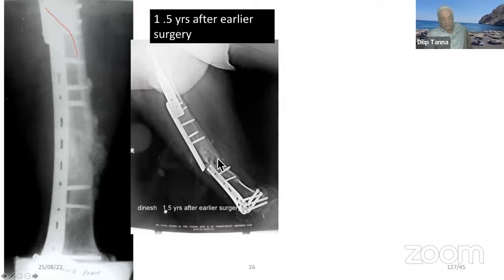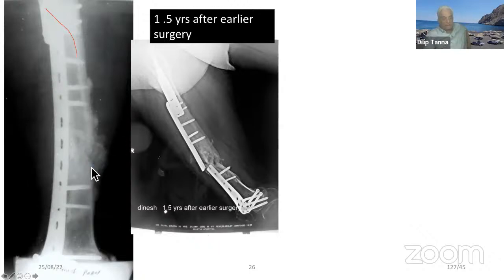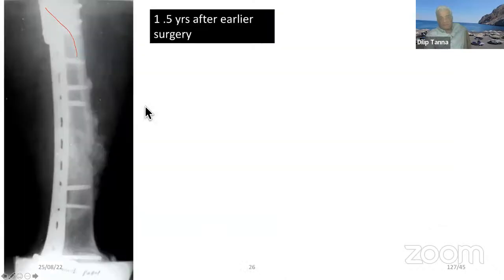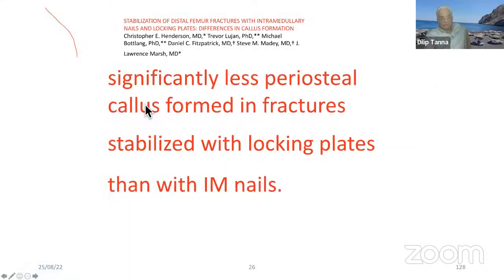In this sort of a fracture, either a double plate would have done, or the easiest is a distal femur nail. You do a distal femur nail, and there is such good bone here that there is no need to do plating. As you can see, if you go proximally, there's good bone there. You can just do a distal femur nail, it would have healed up. Anyway, this is the best treatment, I think. I did the distal femur nail, and things became perfectly all right.